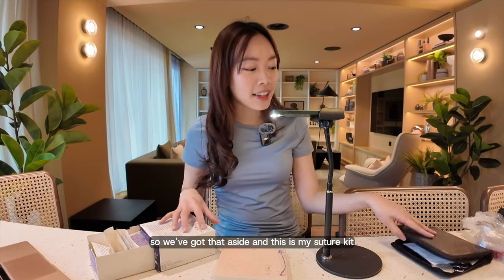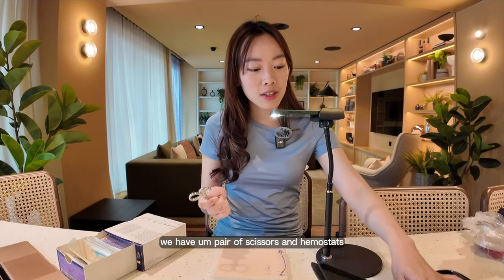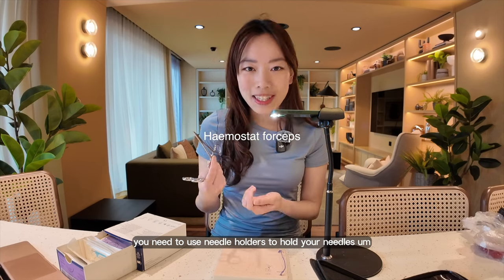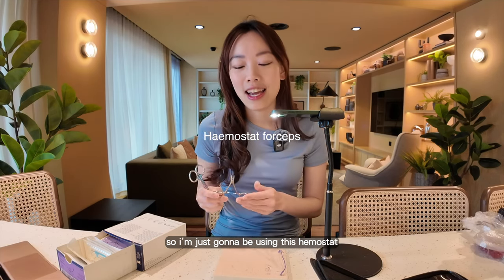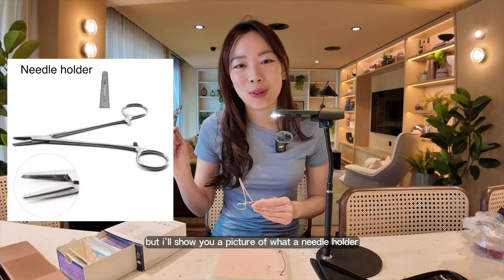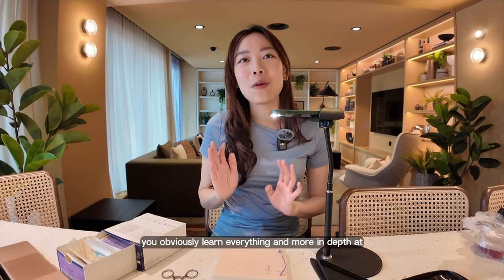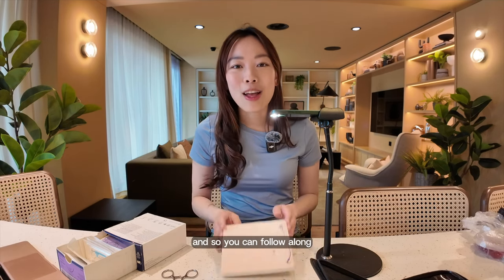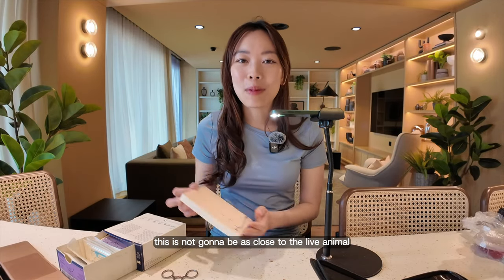So we've got that aside, and this is my suture kit. We have a pair of scissors and hemostats. Usually you need needle holders to hold your needles, but I don't have a needle holder at home, so I'm just going to be using this hemostat — but I'll show you a picture of what a needle holder looks like. You obviously learn everything in more depth at vet school, but we can just run through some basic techniques here just for fun, so you can follow along. This is not going to be as close to a live animal, but it's good enough to start practicing your simple techniques.